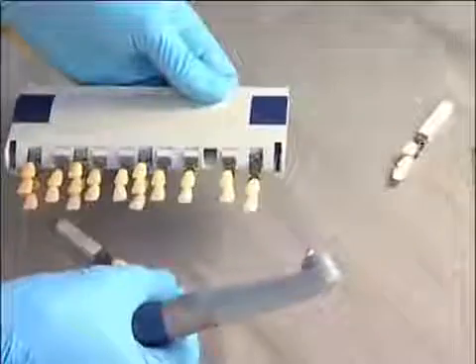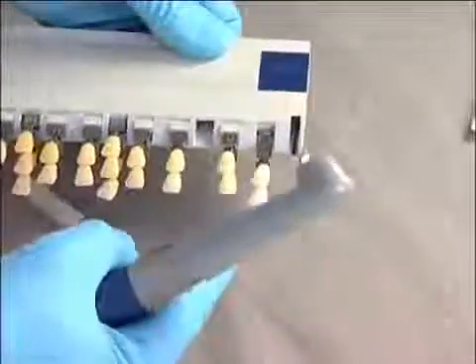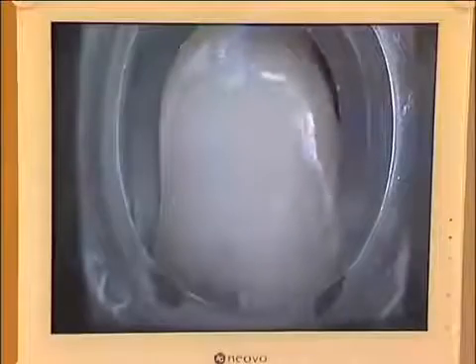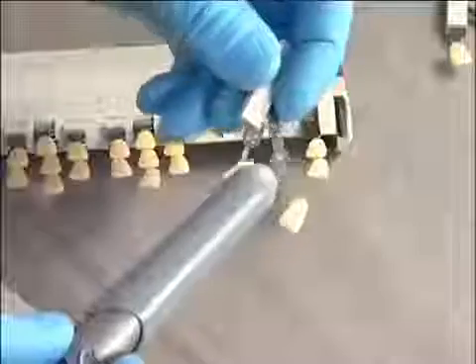In the last step, we select the chromatic hue of the tooth: a more yellow shade, L group, or redder, R group. The samples do not seem correct. Let us see the group of the reddest. The chromatic hue is not perfect with the red group. We come back to the intermediate group. Therefore, our first choice seems to be the good one.